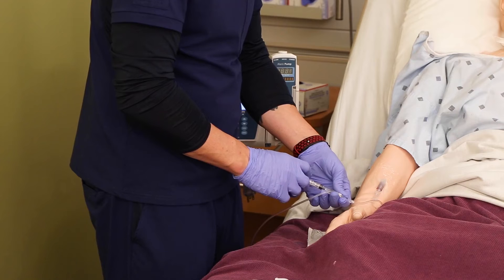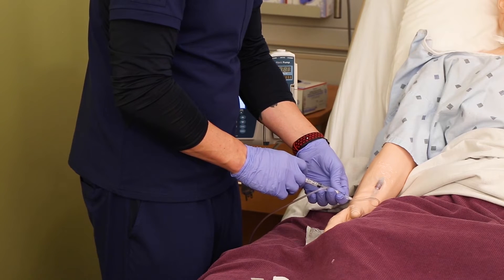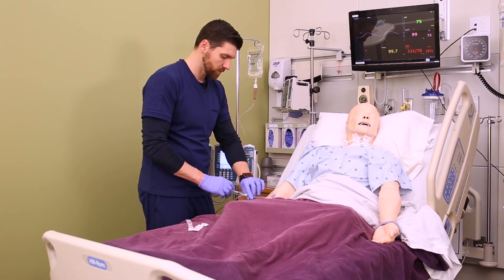In this case you can use a watch with a second hand to track your time, or you can just count nice and slowly. Make sure you're pretty close to an actual 15 seconds to be most safe.